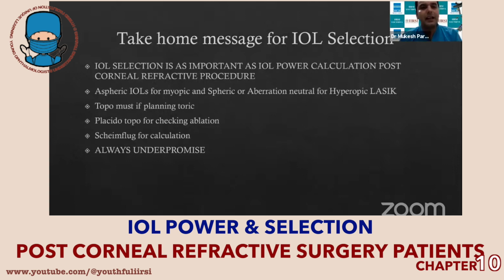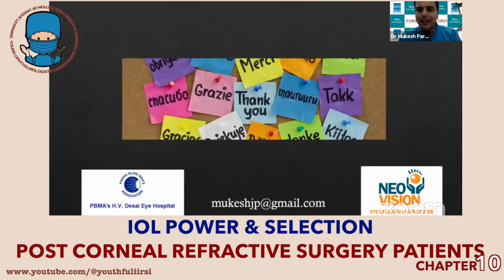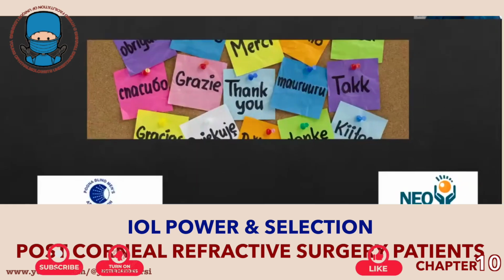And also aspheric IOLs for myopic ablation, post myopic LASIK ablation, and spherical or aberration neutral IOL for a hyperopic LASIK patient. Thank you so much. I kind of finished quick in 12 minutes. Thank you so much.